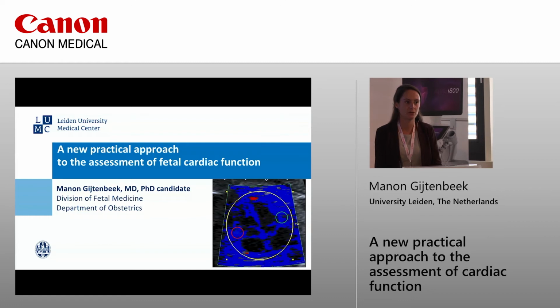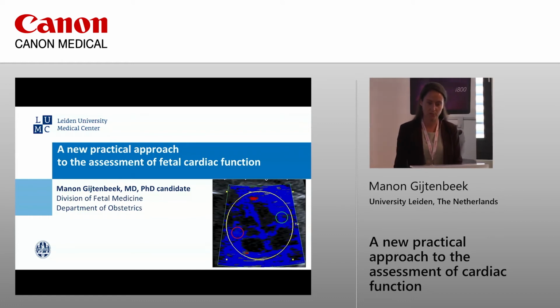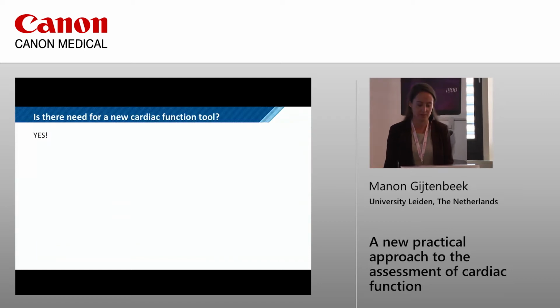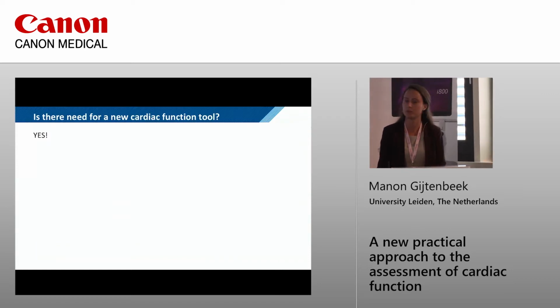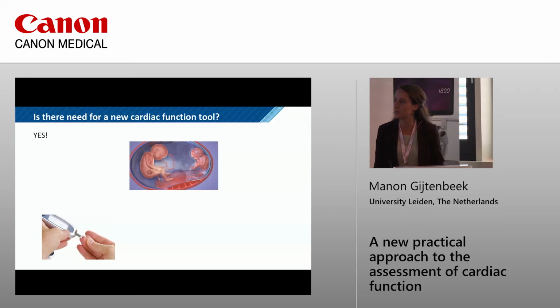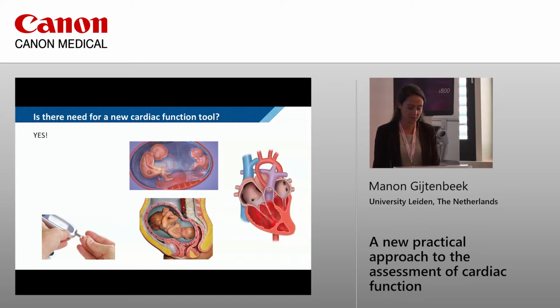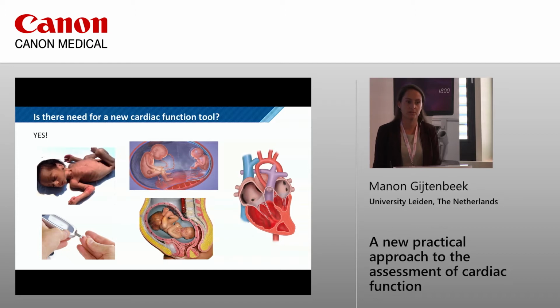I'm going to talk to you about a new practical approach to the assessment of fetal cardiac function. First of all, do we all think that there's the need for a new cardiac function tool? Yes, I think so, especially in a few diseases during pregnancy, like maternal diabetes, TTTS, sacrococcygeal teratoma, or other structural defects, cardiac anomalies, or IUGR.